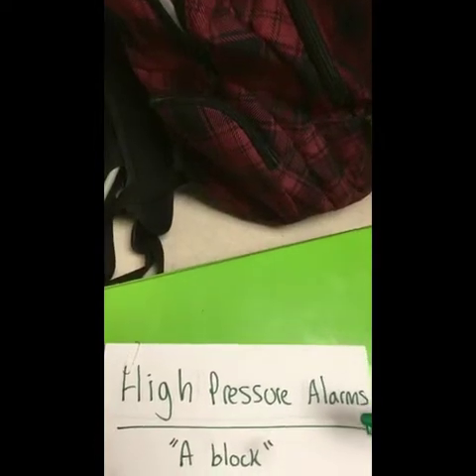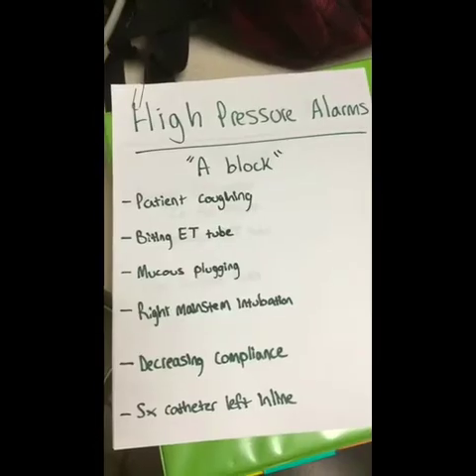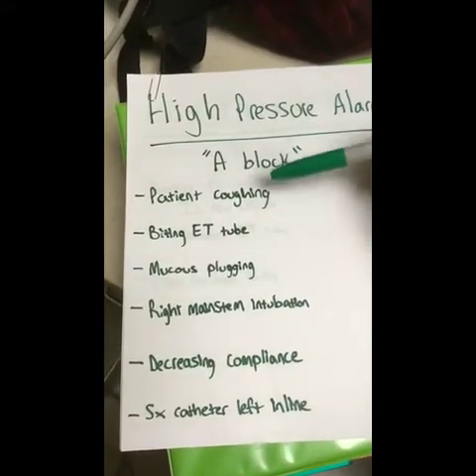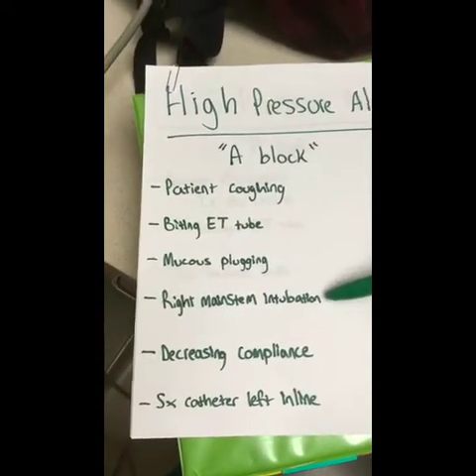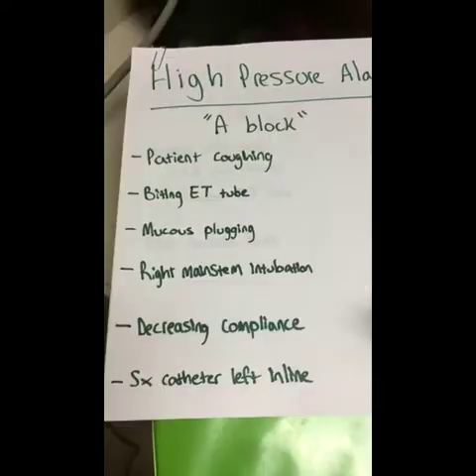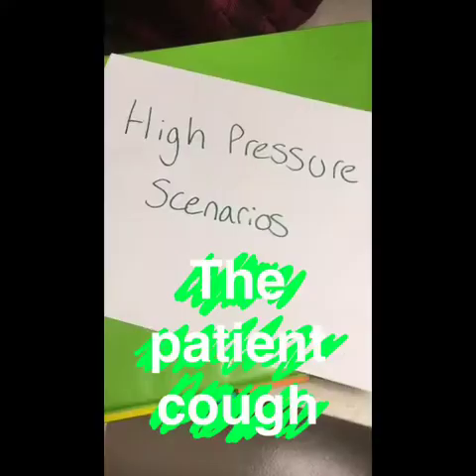We'll start with high pressure alarms. High pressure alarms are anything that disrupts the delivery of a breath. The most common causes are the patient coughing, biting the ET tube, mucus plugging, right mainstem intubation, decreasing compliance, and can also be caused by the suction catheter being left in line.